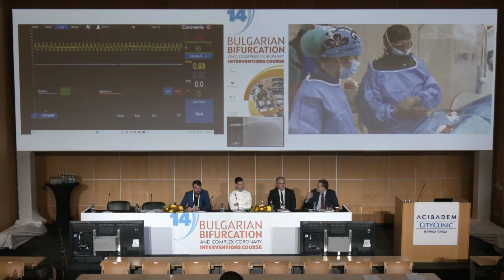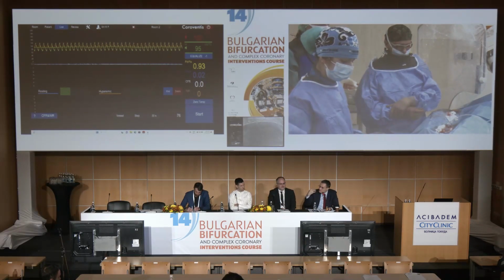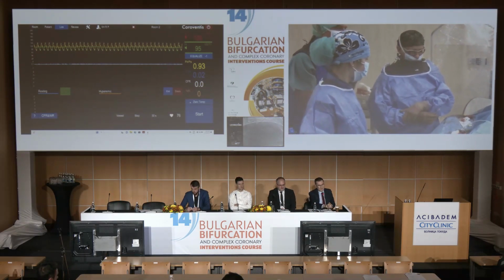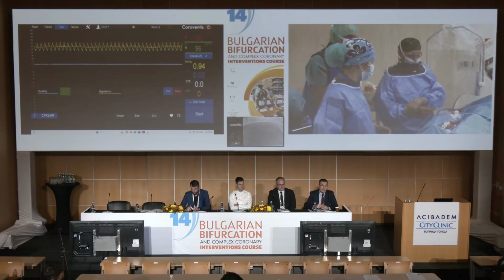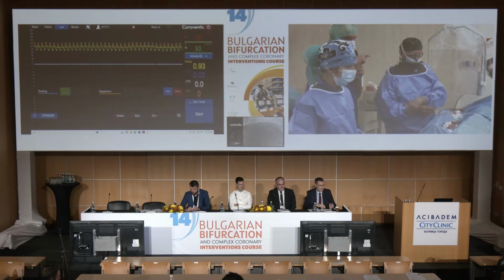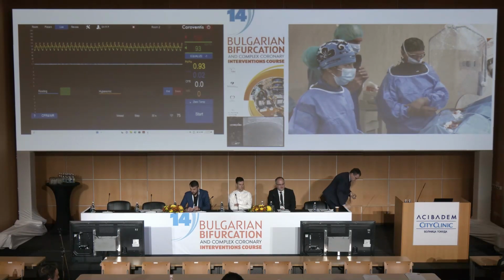So this is why I'm going a little bit more into detail, and it would be good to explain in more detail what and how. Yeah, Dobrin, this is the intention. We were about to go step by step towards bolus thermodilution. And for those who are missing things here, they have to know that there are many lectures where these details will be repeated during the afternoon.